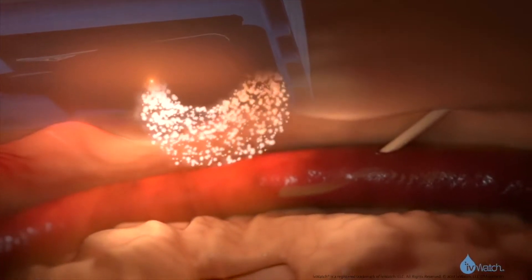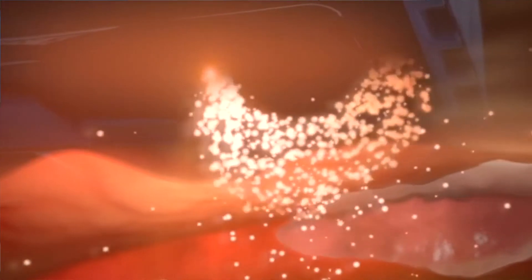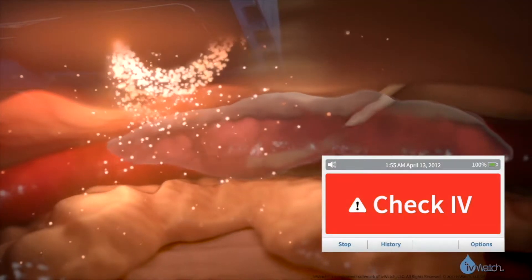The system works by shining light into the surrounding soft tissue and monitoring the amount of light being reflected back. If you have an infiltration, when the light hits that fluid, that light is going to scatter — you're not going to get as much light reflected back into the system. That's going to signal the system to alert you, the clinician, that something's changed and you want to assess the patient's IV site.